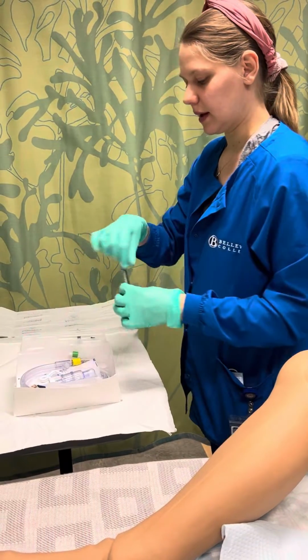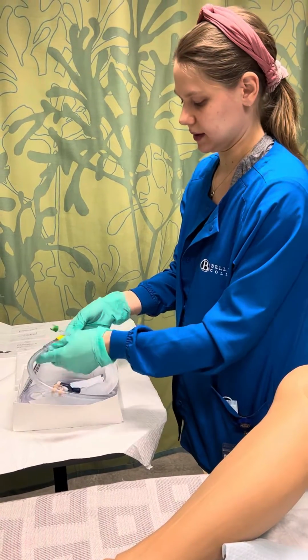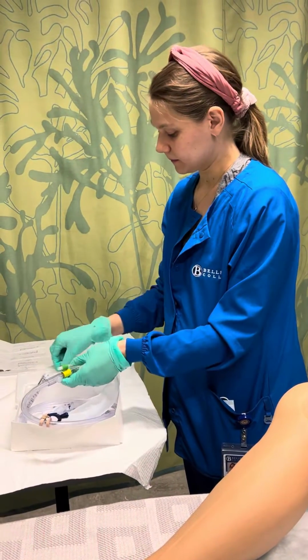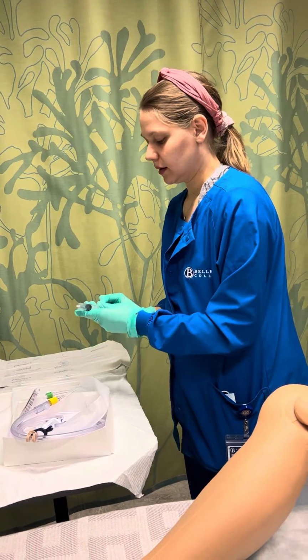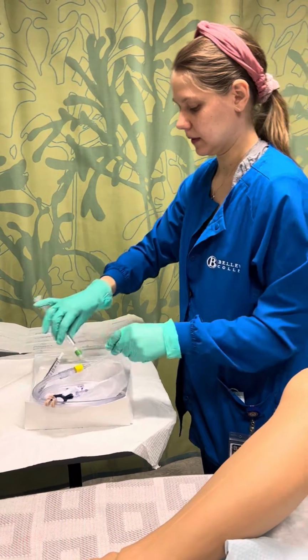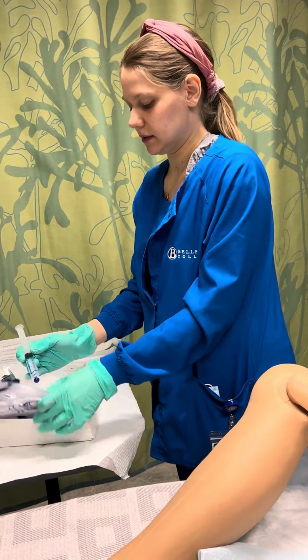I open my alcohol swabs. And I'm just going to once more check the gauge of my catheter to make sure it actually matches up with what's on the order. I'm going to attach my 10 mL of sterile water to my catheter. And I'm going to put my lubricant into the box.